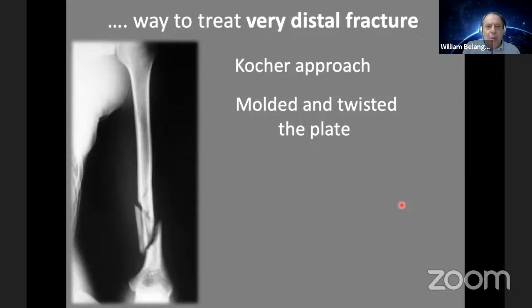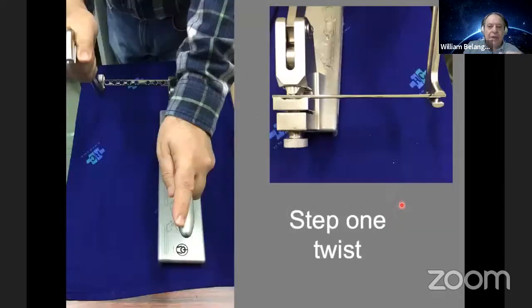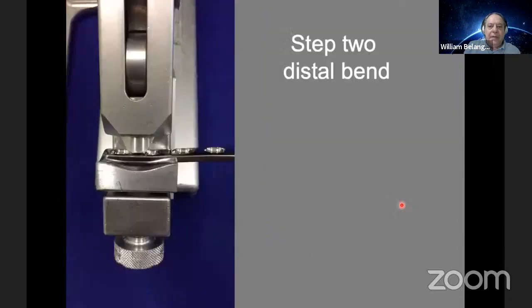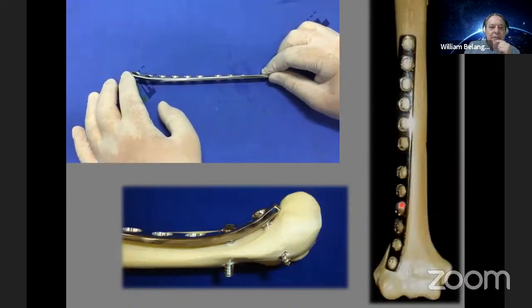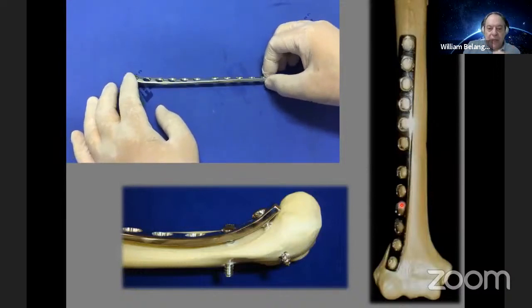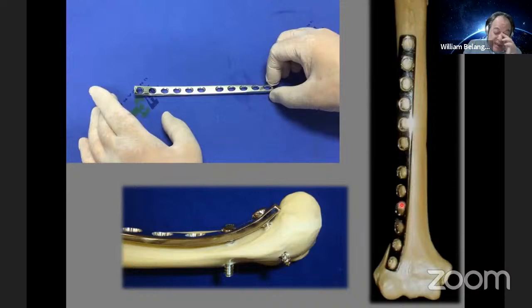using a normal plate, but I mold and twist the plate, and the plate is introduced from distal to proximal aspect of the humerus, below the radial nerve. I make this twist of 20 degrees, then I mold the distal part, I bend the distal part of the plate, and this is the aspect of the plate. After, I fix this in the lateral column of the distal humerus, as you see here, with 2 screws, and in the anterior aspect of the humeral shaft with 2 screws.